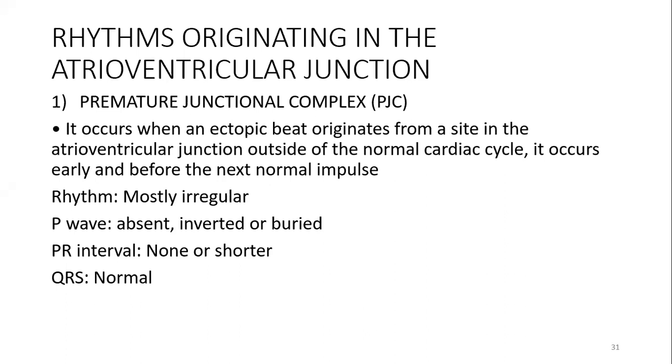The PR interval is either non-existent, if there is no P wave there will be no PR interval, or if it is present, it may be shorter than we expect it to be, that's shorter than 0.12 seconds. The QRS complex is normal.